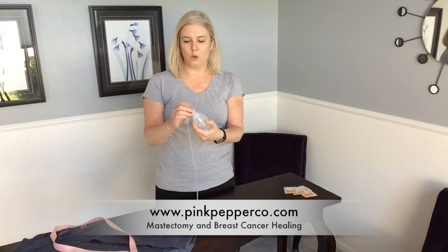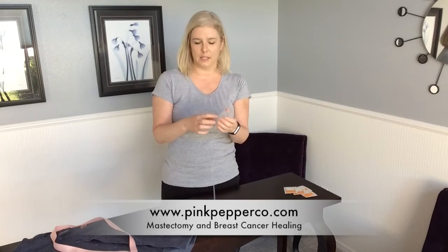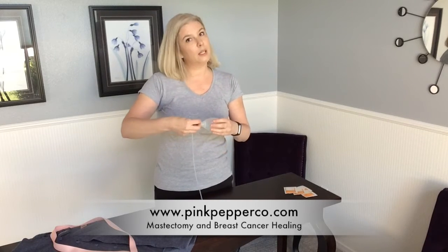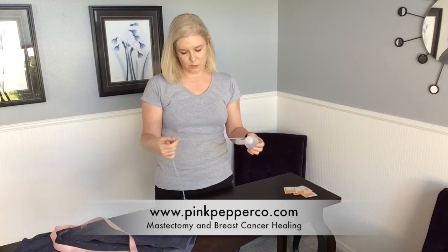That's why there's this little opening here. They're going to want you to pour it out and keep track of the fluid that's in it, and you're going to probably keep track of that on a piece of paper for them and call in. Again, they'll give you all those instructions.